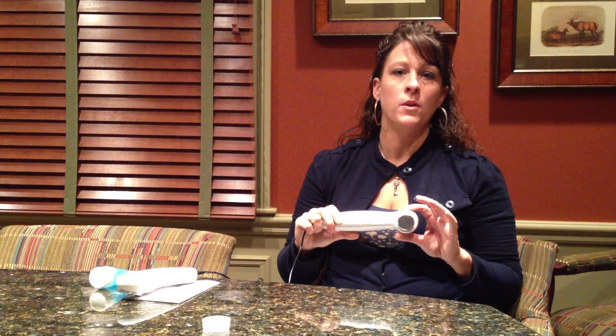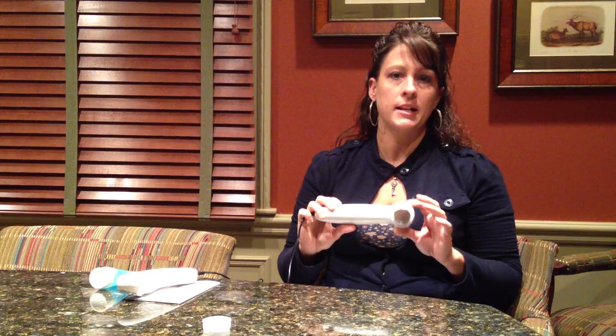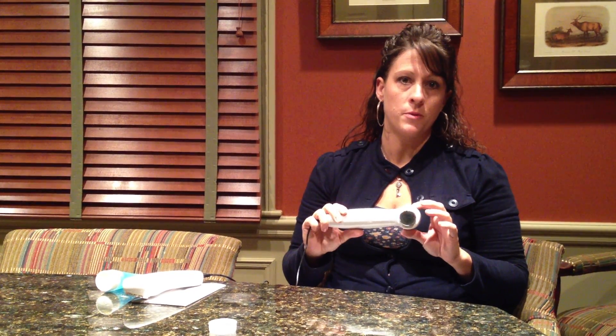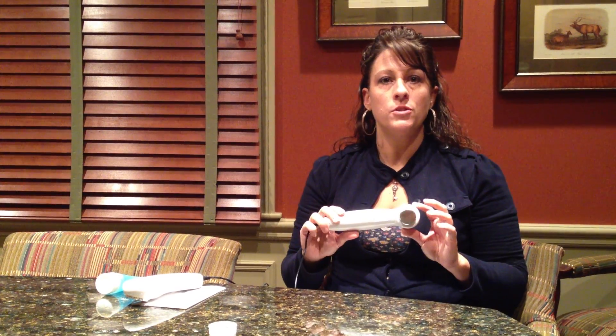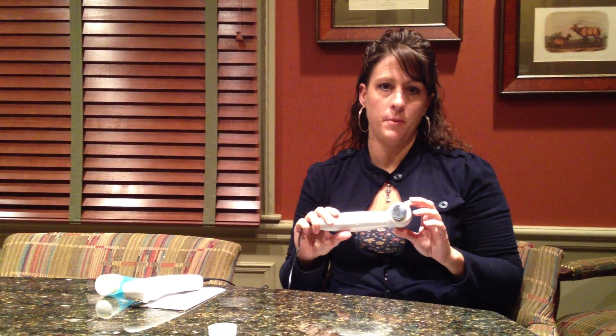Thank you for purchasing the US-1000 or the US-PRO-2000. You've purchased a great unit with good quality craftsmanship. However, you may be experiencing some technical difficulties with your unit, and I'm here to help assist you with that, along with your prescribing clinician. The ultrasound is used for pain relief through deep heat therapy.